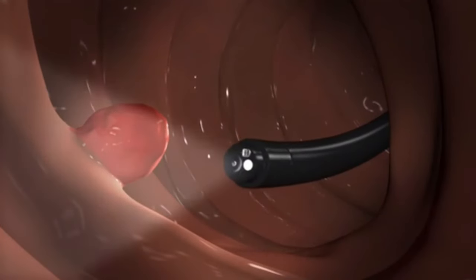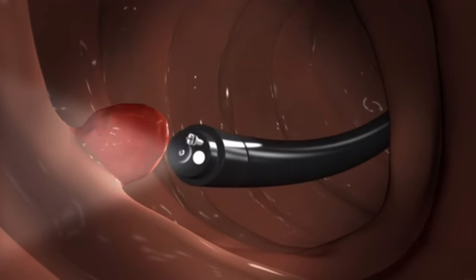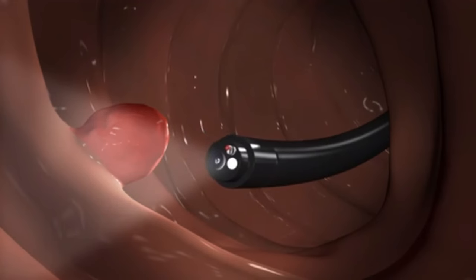Using small tools inserted through channels in the endoscope, he or she can take small samples of tissue to send to a lab — this is called a biopsy. In some cases, your provider will remove small growths. The endoscope is then removed.